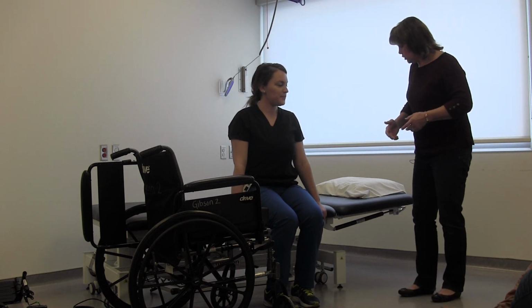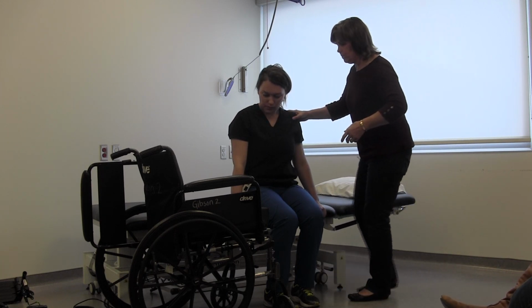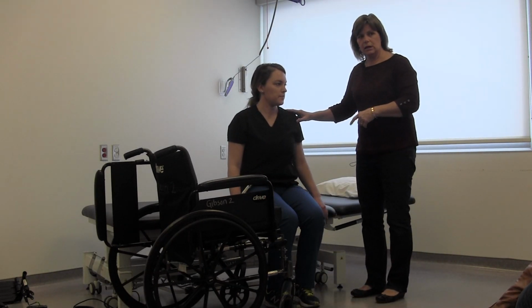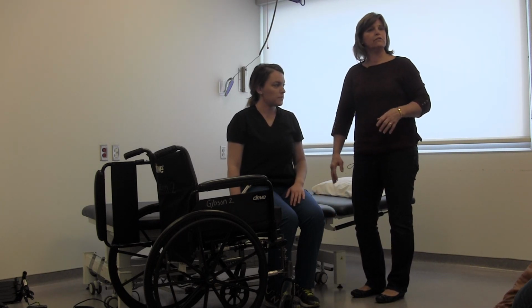Okay? So what we're going to do, I'm going to see if I can lower this bed anymore. I don't think I can. No. Okay? So I'm just going to bring this a little bit closer. So this is Annette's affected side, so I'm going to get in here pretty nice and tight. We're going to put her arm on her lap. It's going to give her support.